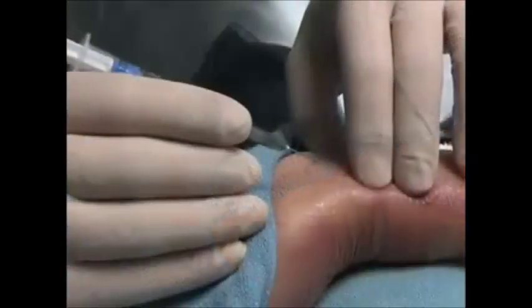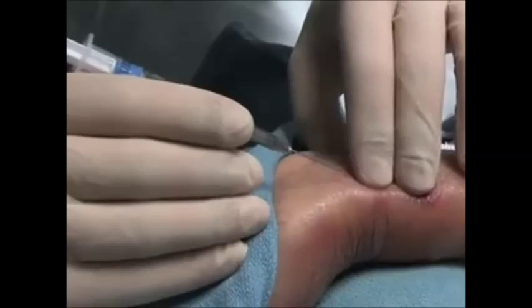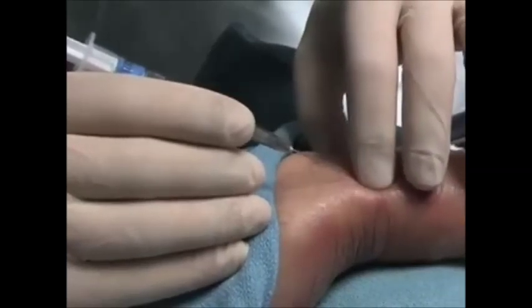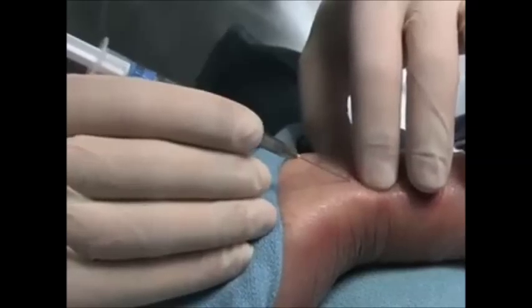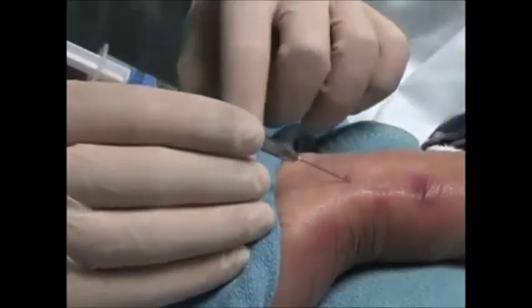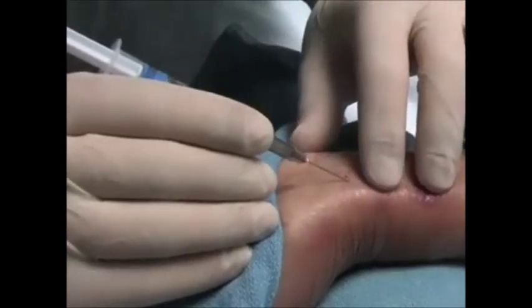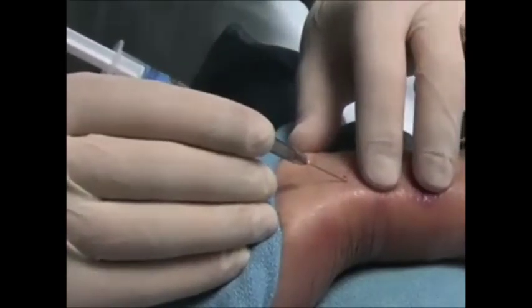Again, locate the maximum impulse with the index and middle fingers of the non-dominant hand. Holding the arterial blood gas syringe with the dominant hand, aim the needle away from the hand and toward the upper arm, and puncture the skin at a 30 to 45 degree angle at a point just below the index and middle fingers of the non-dominant hand.